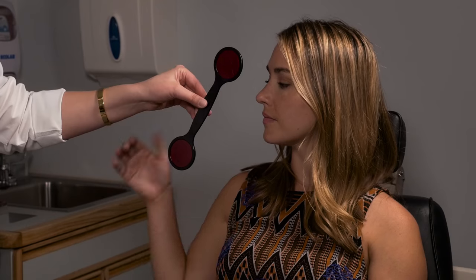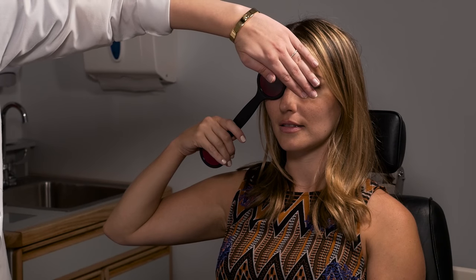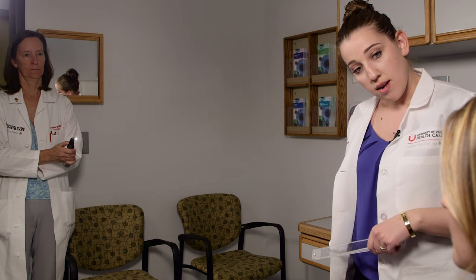Have your assistant hold a muscle light at the end of the room. Can you appreciate that there's a horizontal red line when looking through your right eye? You can rotate it to make it perfectly parallel with the floor. When looking at the white light, is it above or below the red line? Right on — so she's very well aligned, meaning the light and the line are at the same level.